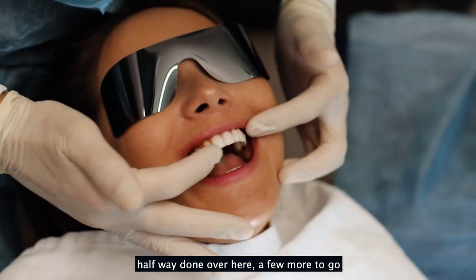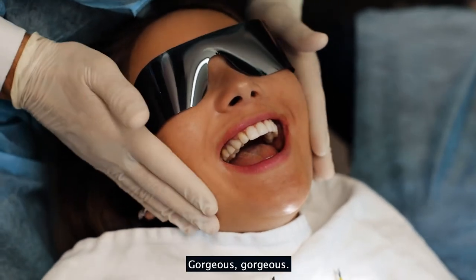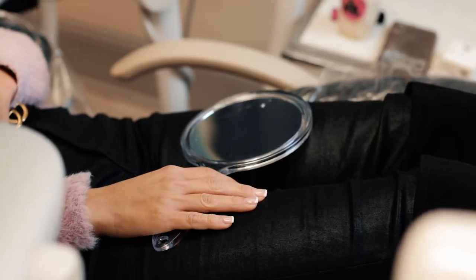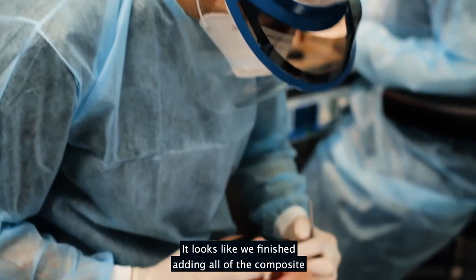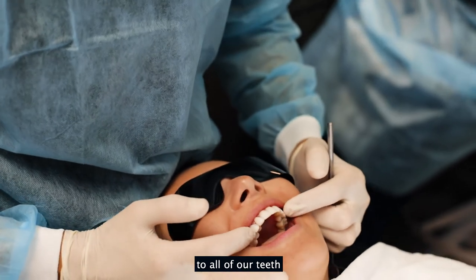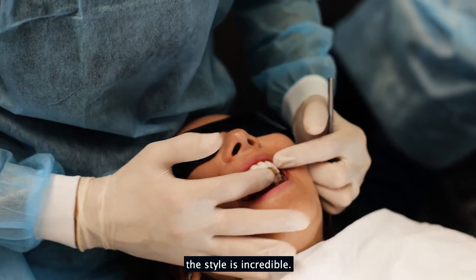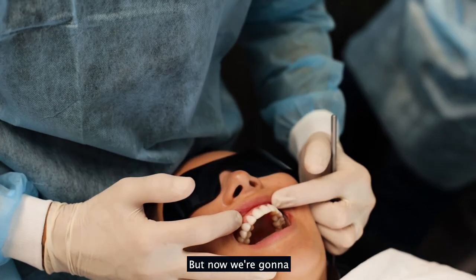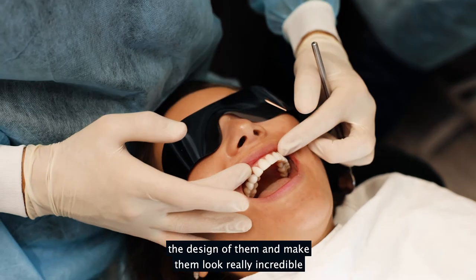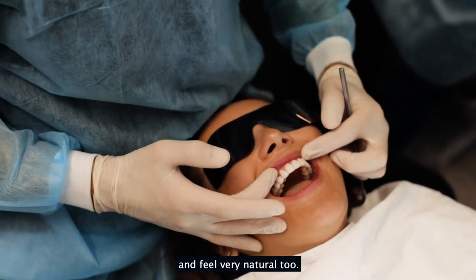That's just about done — halfway done over here, a few more to go and then we'll finish up. It looks like we've finished adding all of the composite to all of the teeth, which are now bonded. The shape is incredible, but now we're going to really refine the design and make them look truly incredible and feel very natural too.